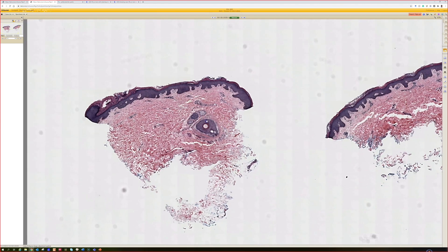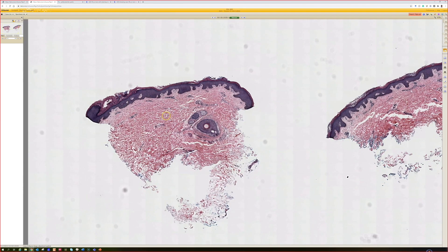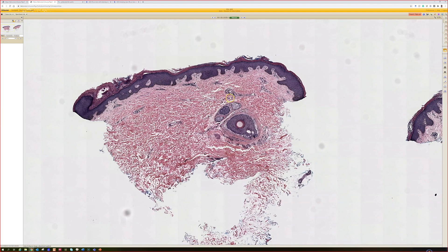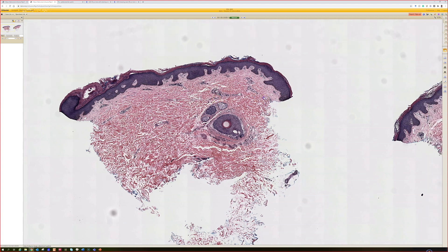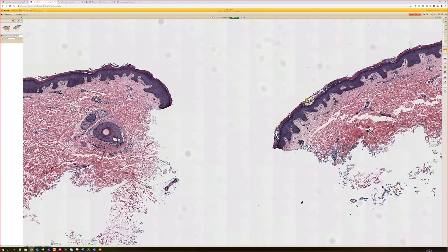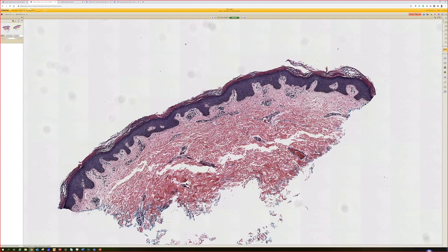Case two — let's say we're in the axilla or the groin, a fold site. I thought this one was challenging. I thought it was sort of a normal skin differential. There's some compact orthokeratosis — that's the key right here.